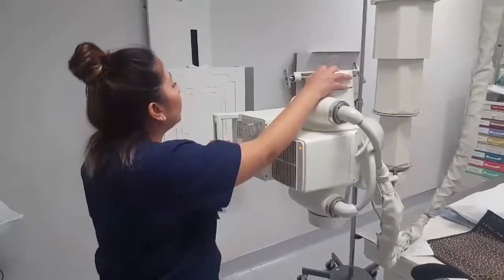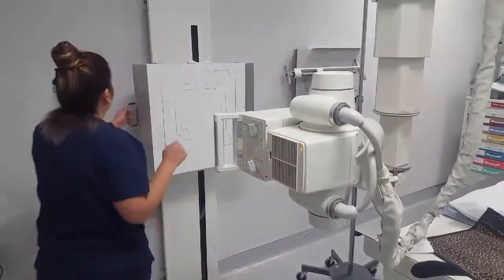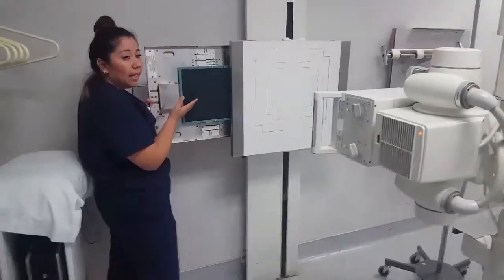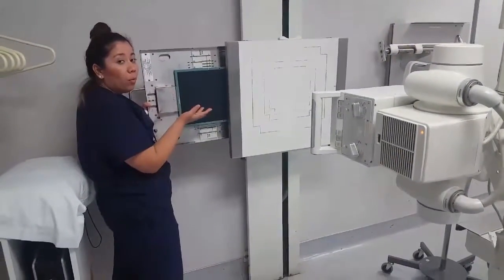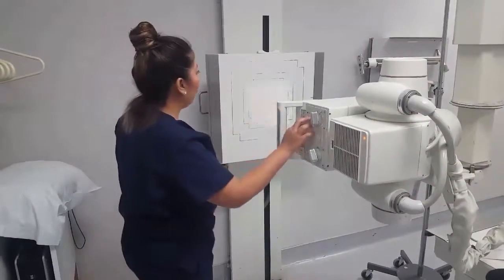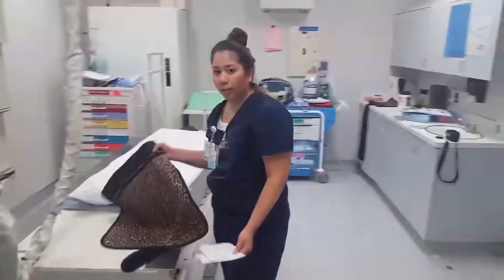Angling to 90 degrees. And then next, making sure that I have my IR in here, which is already in place, and it's in a landscape orientation, and it's a 10 by 12. Take that back in there. Next, I'll be getting my patient. And I have my shield here ready to go as well.